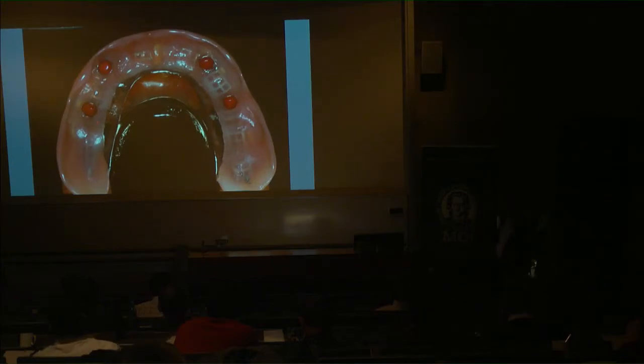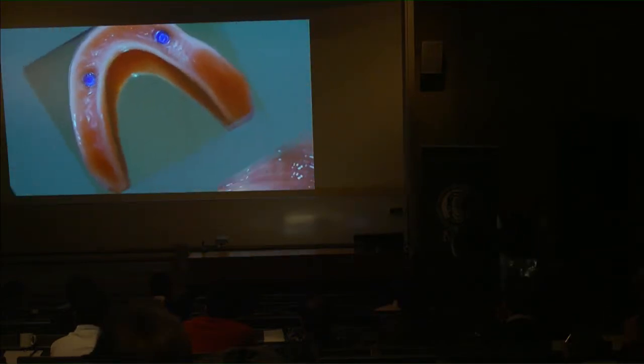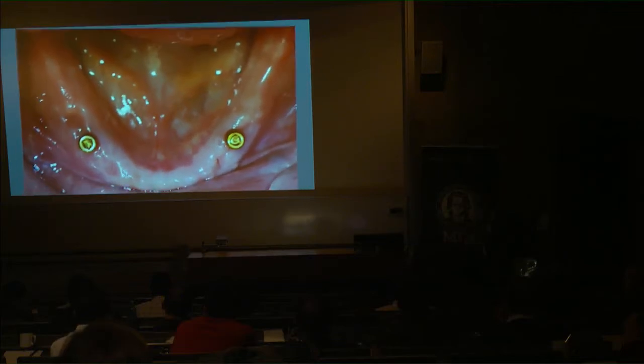And they were all provided with an implant-supported overdenture with a framework displayed as a horseshoe in chrome cobalt or titanium with an uncovered palate. And the idea of an uncovered palate is very good. All my patients, without exception, say that they get more intensive flavor sensation when they don't have the palate covered. So this is how it looks in vitro. The lower, and in the mouth.